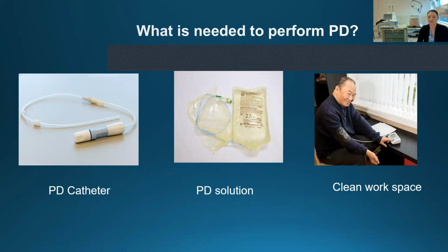So what is needed to perform PD? So first of all, you need a PD catheter, PD solution, and a clean workspace.